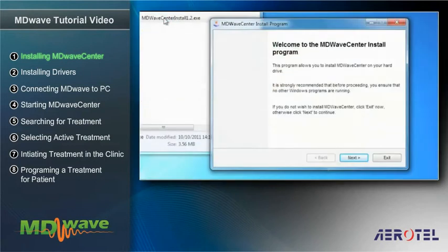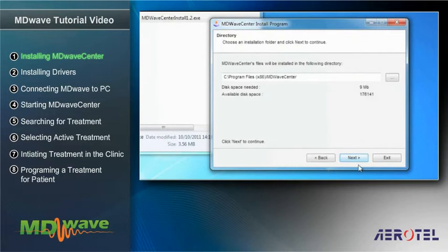In the following stages, a number of windows related to the program's installation will appear on screen. In the first window, Welcome to MDWaveCenter install program, click Next. In the next window relating to selecting the installation library, click Next.